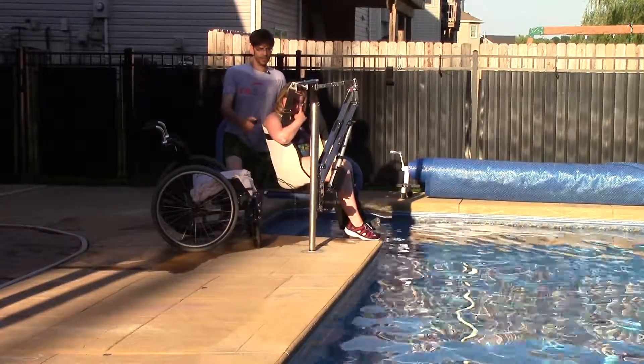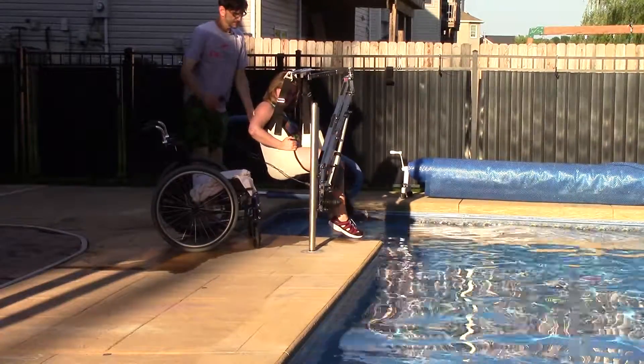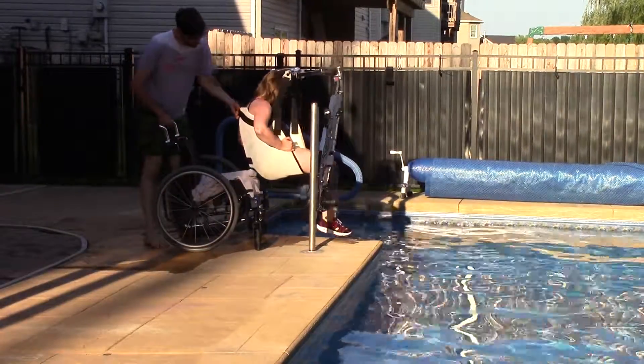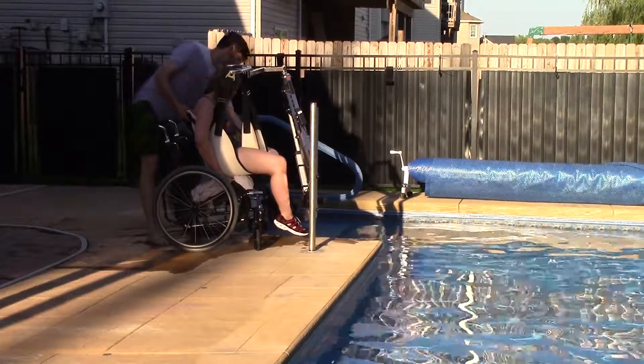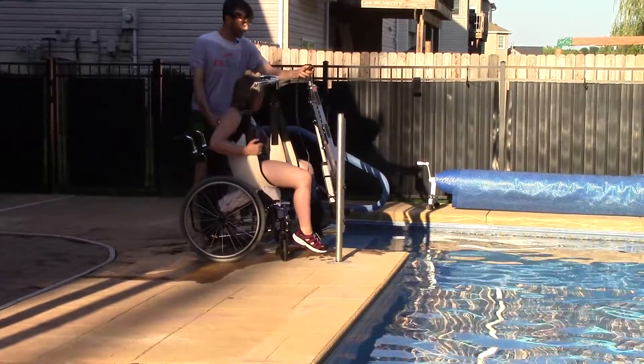Say you want to go for a swim and then you want to go out for an ice cream — which is I think a good combination. We can do that. Next we just go right over the wheelchair and line up the legs.